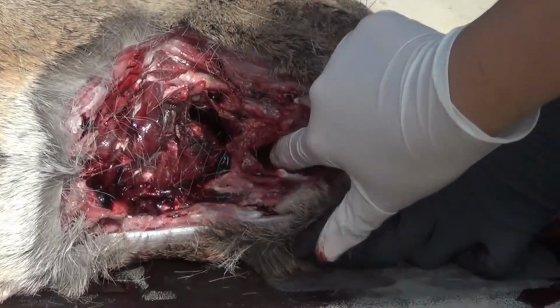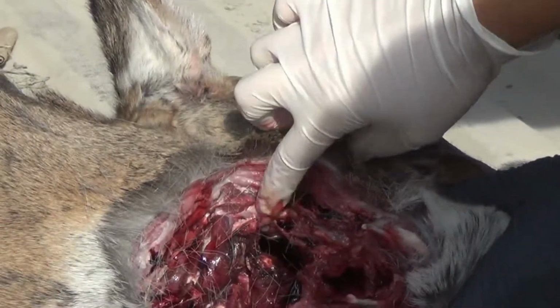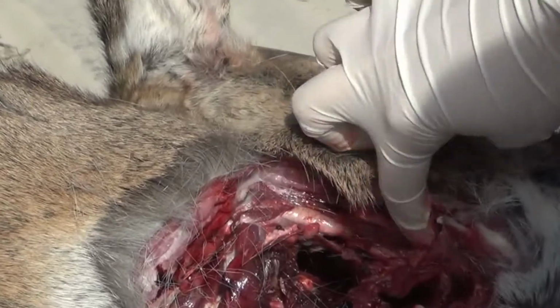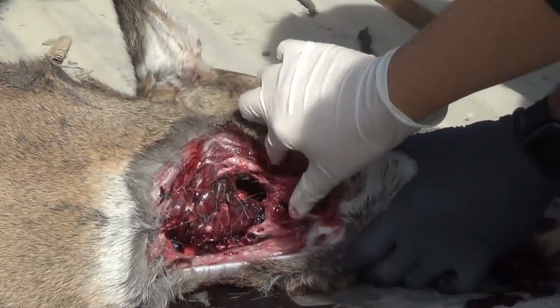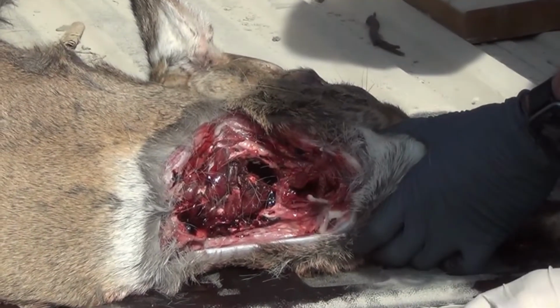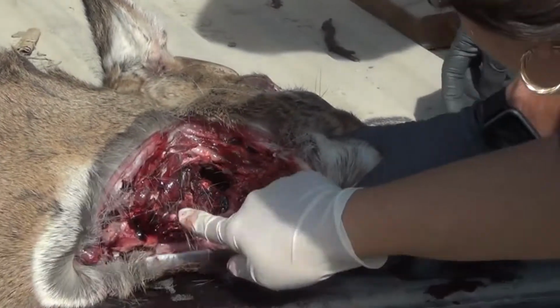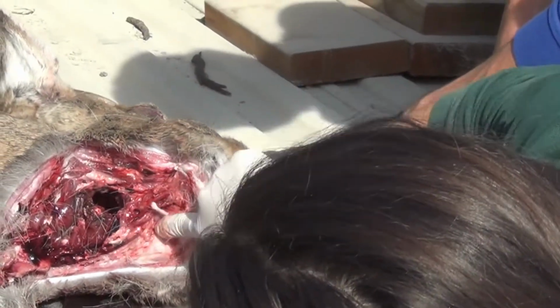The tissues that we want to find, the retropharyngeal lymph nodes, are going to be on either side, and you kind of have to orient a little bit, but they're going to be on either side of this larynx or laryngeal structure. So next, I'll point out maybe a couple other tissues now that I'm seeing them.